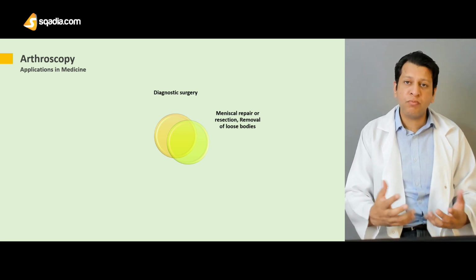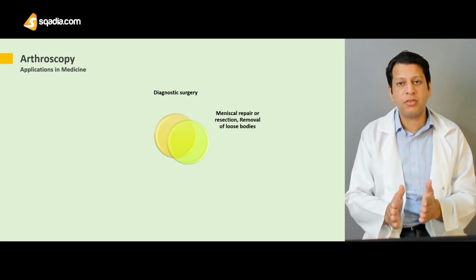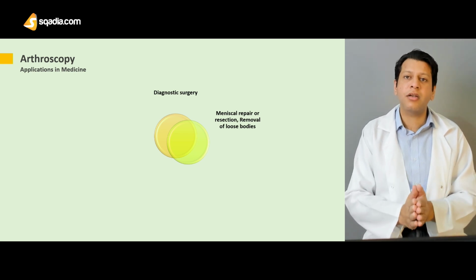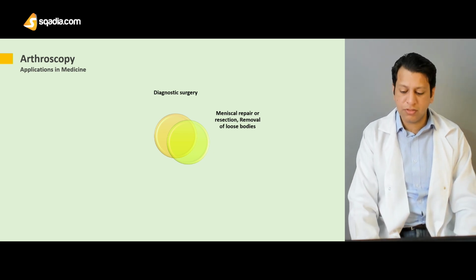Now with the advent of modern day arthroscopy, we can not only diagnose it, but once we have diagnosed that the problem is with the meniscal tear over there, we can repair it as well as resect it there and then, without actually opening up and using an open incision for this procedure.